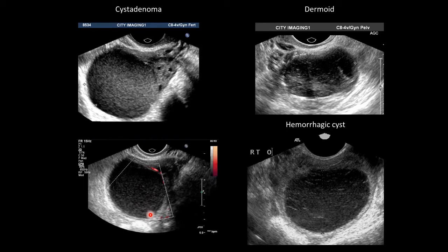That is called acoustic streaming, and endometriomas usually do not display acoustic streaming. So if something looks like an endometrioma but it displays significant acoustic streaming, it's not a reason to say it cannot be an endometrioma, but I would have more doubt, and therefore I would go and look very carefully for associated lesions, which then may confirm or lessen the suspicion of an endometrioma.